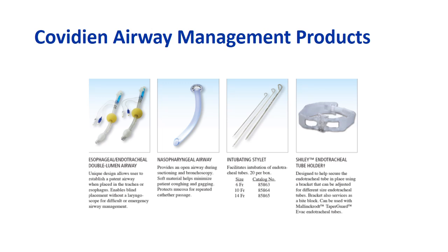Finally, this slide shows Covidien airway management products, which probably fall more into the adjunct or supraglottic range, with an esophageal endotracheal double lumen airway, which is a device that I've actually never seen. A common nasopharyngeal airway, the intubation stylette, which, as you can tell from this slide, comes in 3 sizes and begs the question, why do we only have 1 or 2 sizes at the University of Kentucky? And finally, a Shiley endotracheal tube holder.